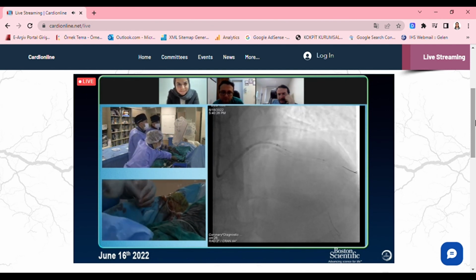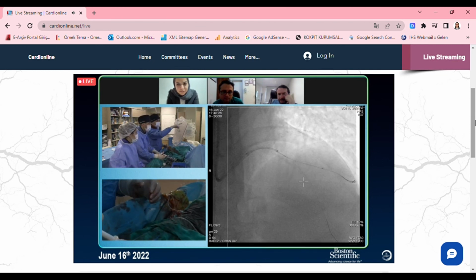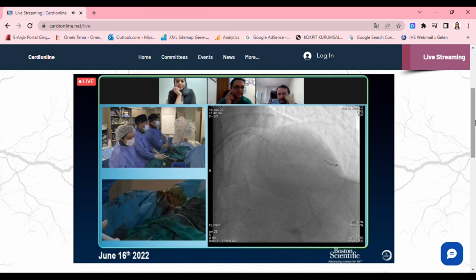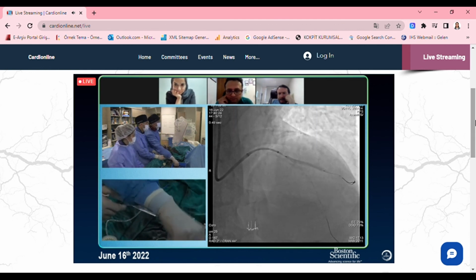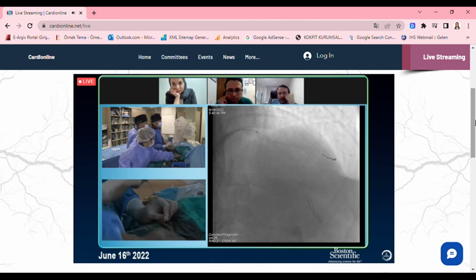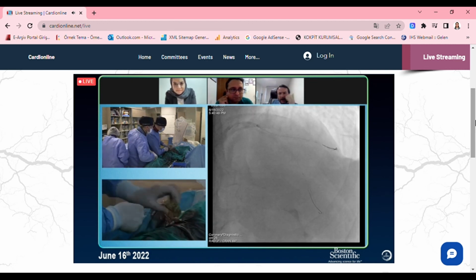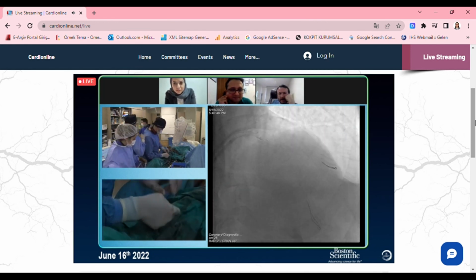Show me there. I don't like the proximal part. The proximal, what do you think? It's not opening. Okay. Go up. 3.5. Do you want to take a 3.5 NC first? NC? Yeah, 3.5 for pot, yeah? No, 3.75. 3.75 NC.